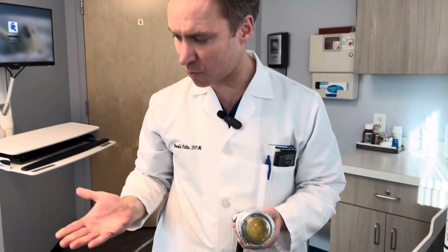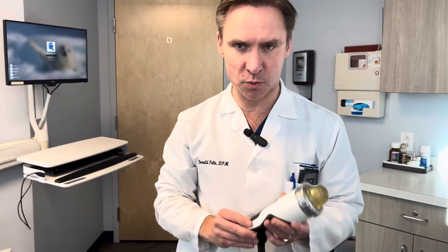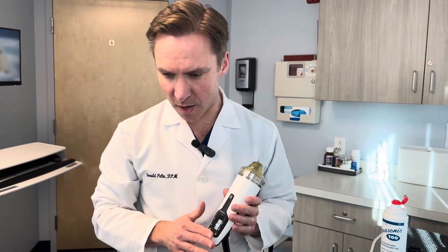Those are the main tips for doing shockwave for patients. I usually do 2000 pulses of the focused. The focused can also be used on arthritis, midfoot arthritis, sesamoiditis, painful accessory bones, all types of soft tissue, fractures because it has bone penetration, and osteochondral defects of the talus. For very deep areas, treatment will be more painful, so you have to be patient and titrate accordingly. I always start low and increase according to their pain tolerance.